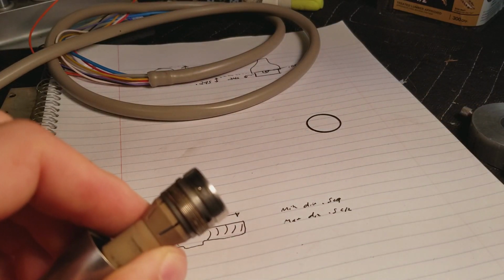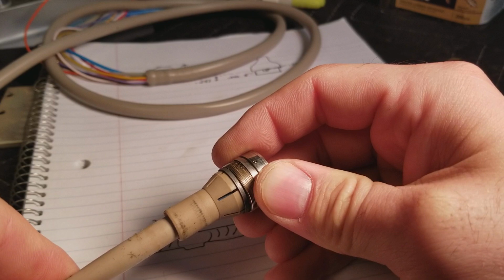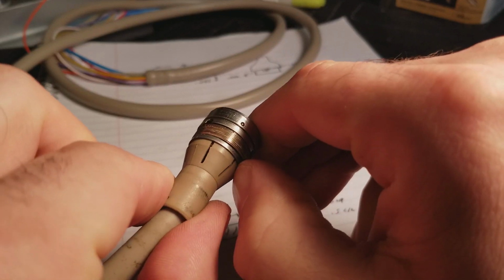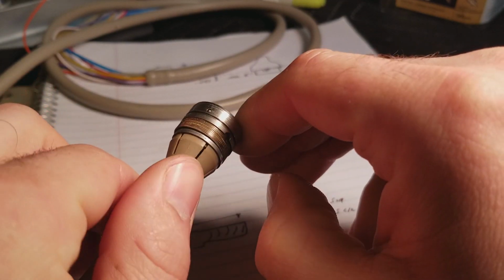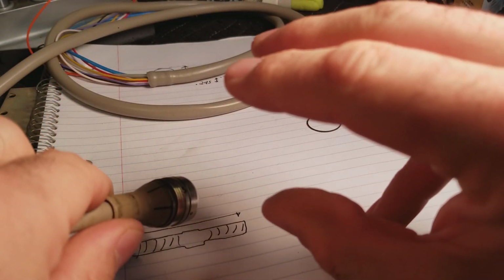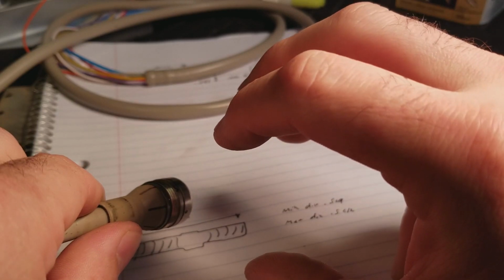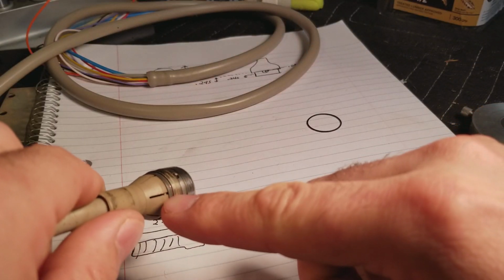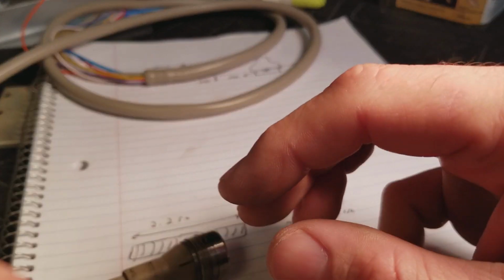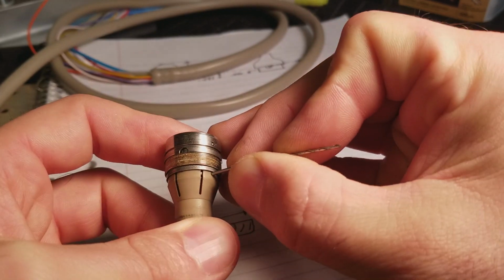Now, the next thing is you've got to get this plastic component off of here, which is caging the strain relief of the silicone tubing up into this component right here. So you'll notice this thing compresses. There's a little ring that goes around here. What it's doing is the collar slides over these fingers, that they're snapped around a ring inside here. So what we have to do is move the fingers out to let it release. Well, that metal ring here keeps those fingers engaged around that collar so it doesn't want to let go. So just use something to lift this metal ring. So what I did is just lift up this metal ring like so.